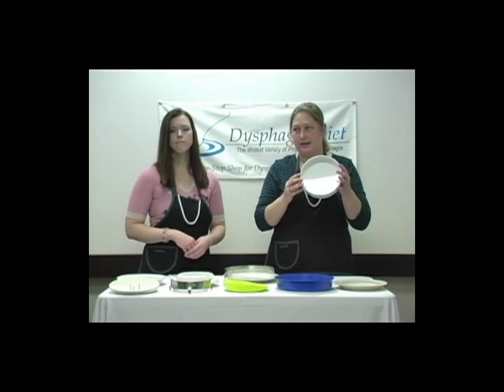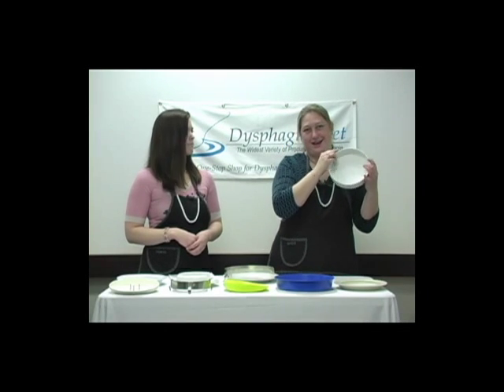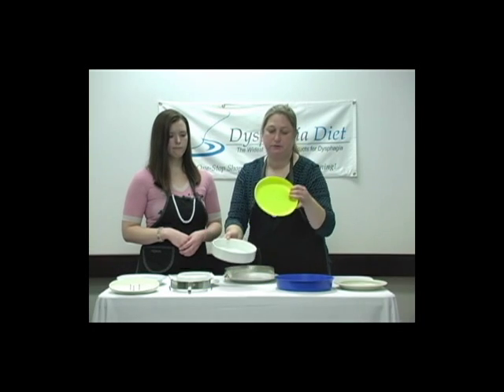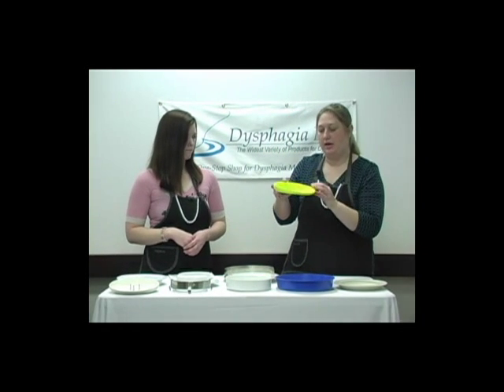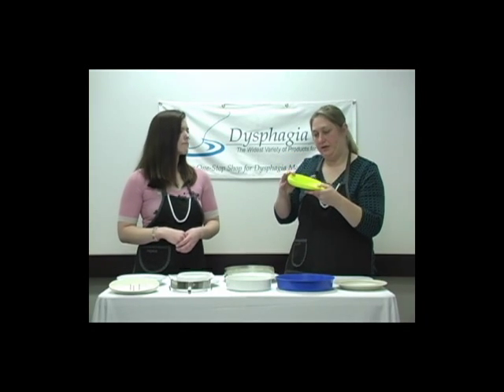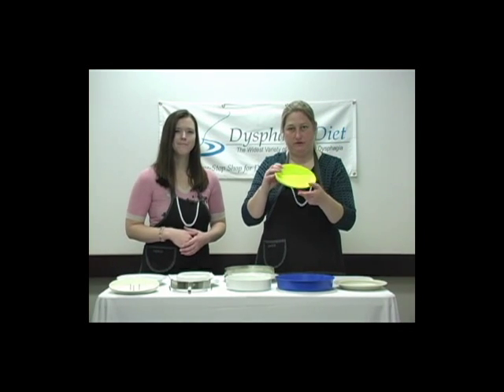This particular high-sided dish has a high side all the way around. So when you look around, you see it's all the way around. This particular one, which is a scoop dish, has a high side on one side and it's almost flat on the other, allowing for someone to easily scoop the food out of the dish.